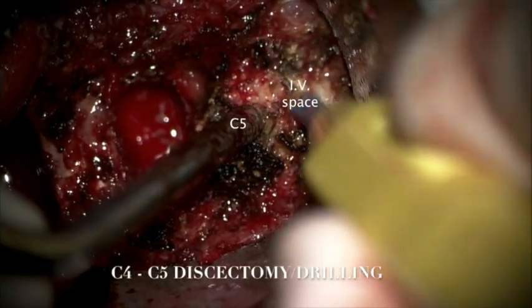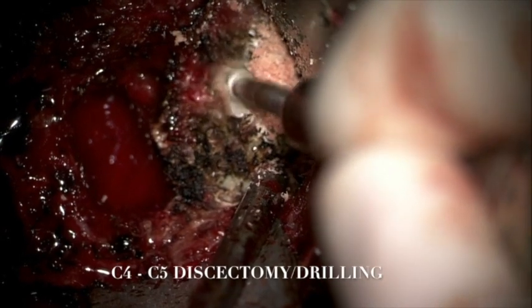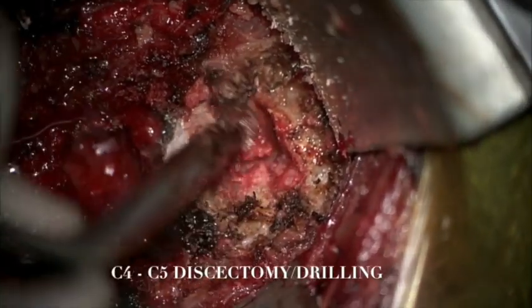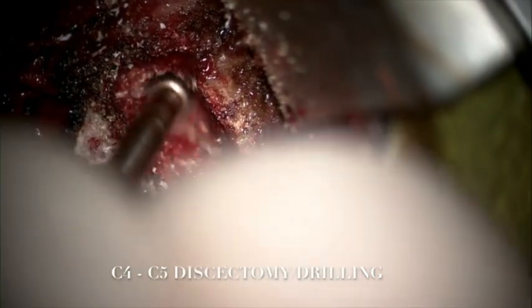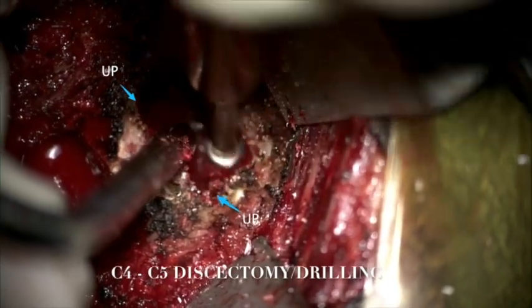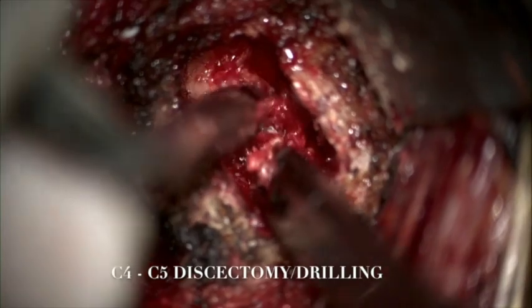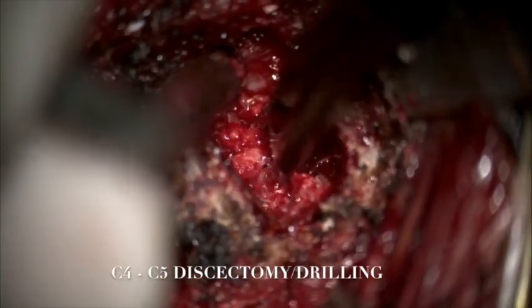The same was repeated at the C4-5 level. We drilled out the inferior lip of the superior vertebral body and then resected the soft material with pituitary rongeurs. We identified the medial aspect of the uncinate processes on both the right and left sides. Drilling of the cartilaginous endplates was done, and then 1-millimeter and 2-millimeter Kerrison rongeurs completed the resection of the posterior longitudinal ligament and disc osteophytes.